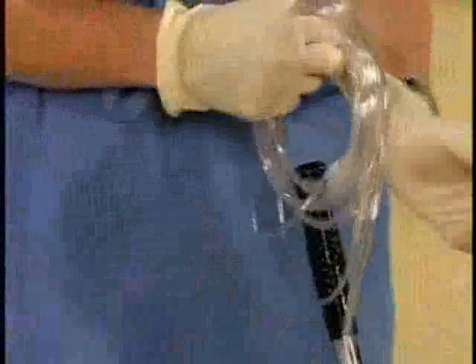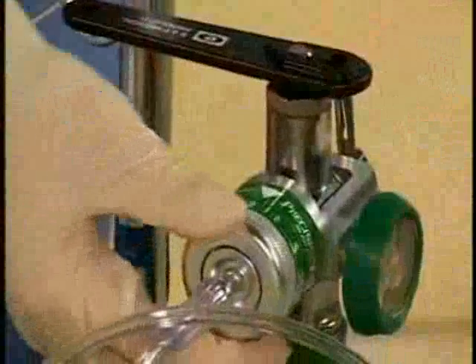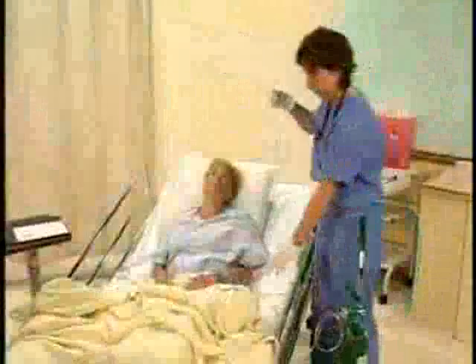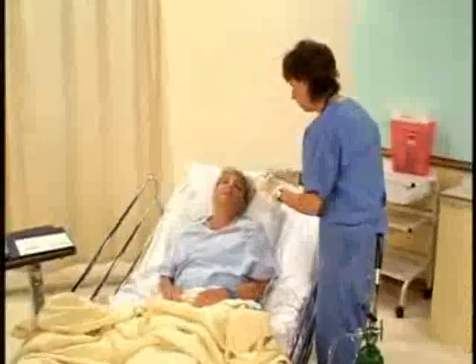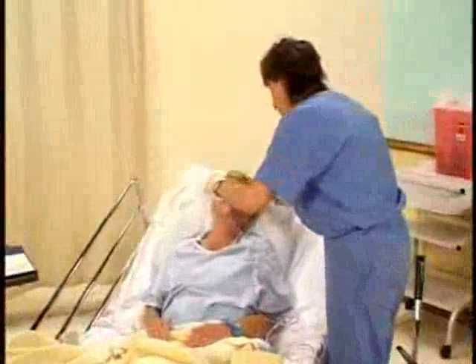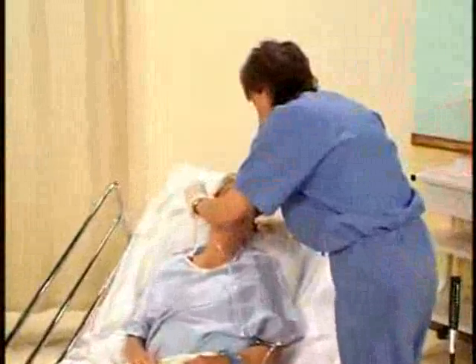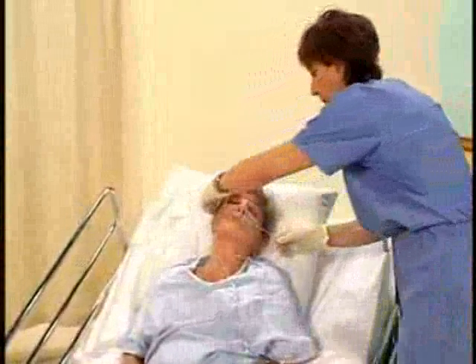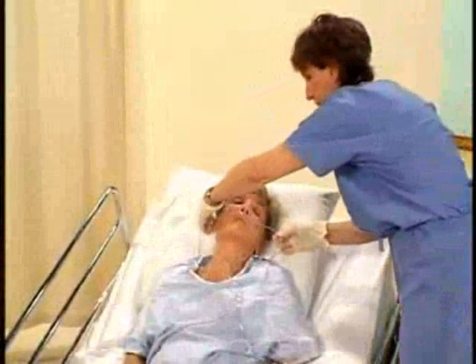Attach the oxygen tubing and nasal cannula to the oxygen flow meter. Put on clean gloves, turn on the oxygen, and set it to the prescribed flow rate. Use extension tubing for ambulatory clients.